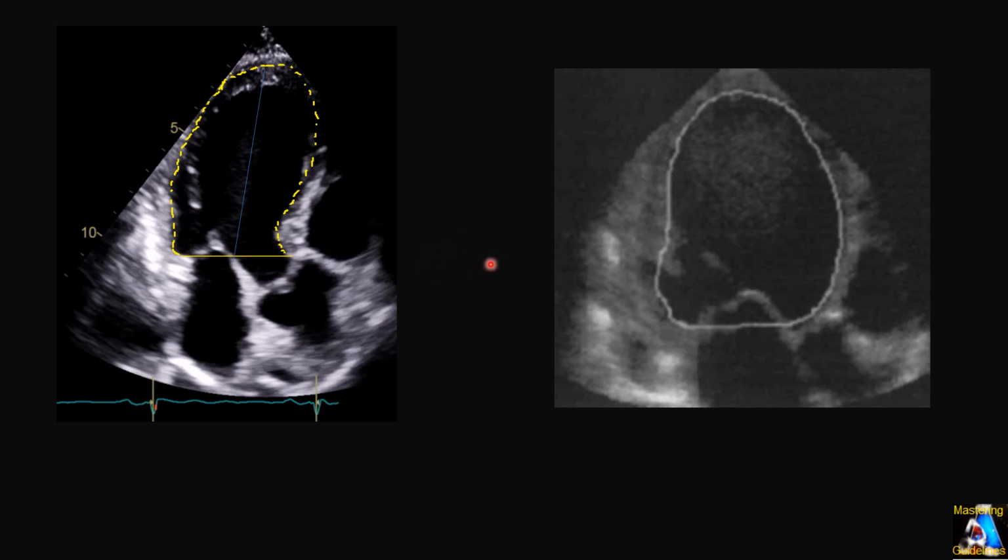So just keep in mind, if you practice, it's not a bad idea. Practice and see which one in your case will be more accurate and more sensible and approvable for every measurement.